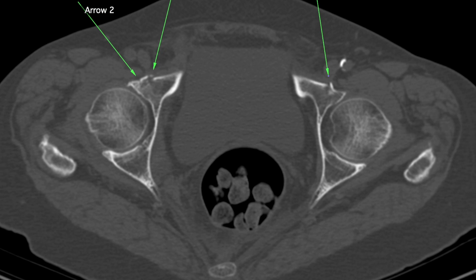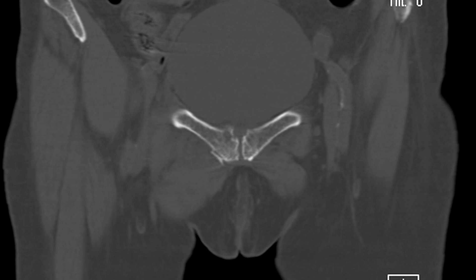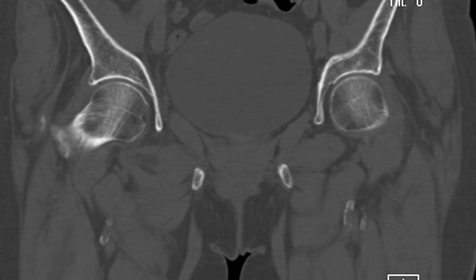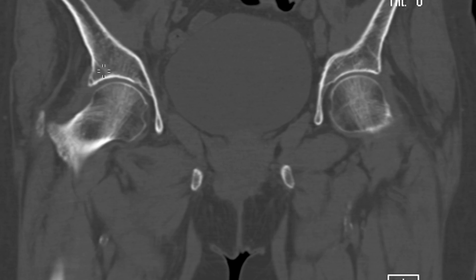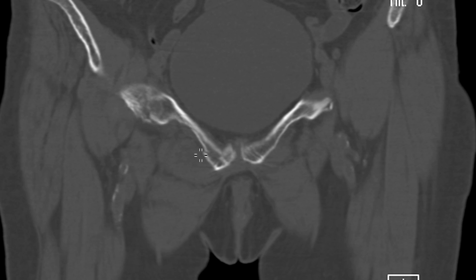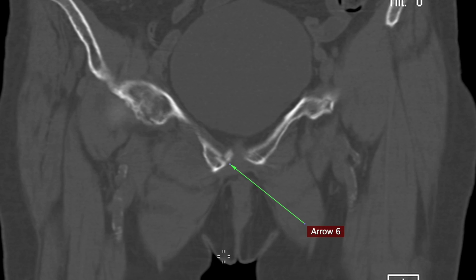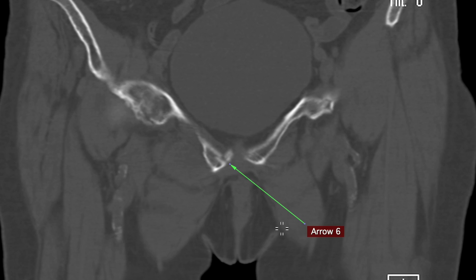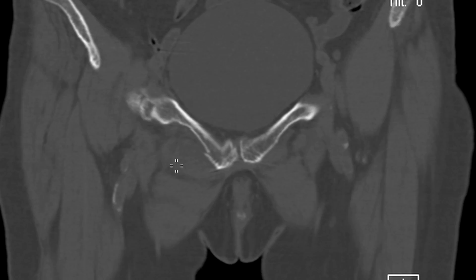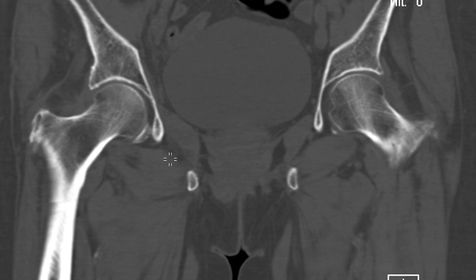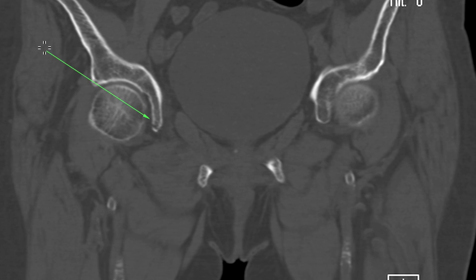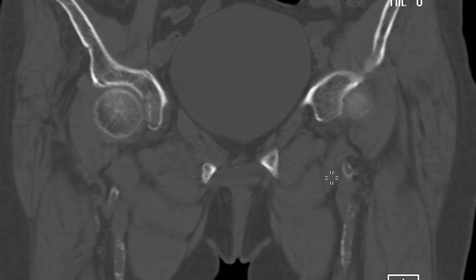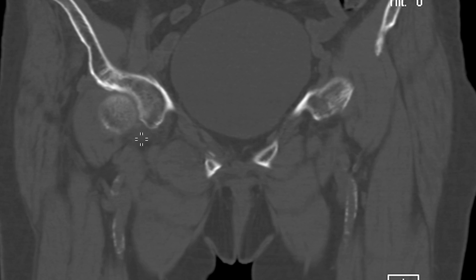Then looking at the other side, something catches our attention — we also have some cortical disruption there, so there's another fracture on that side. For those who are not radiologists, it might be hard to see on the axial projection, so the coronal projection is a lot easier for learning this type of imaging because it correlates with the radiograph. Going back to the radiograph view — we have that fracture there; it's not identical to what we saw on the radiograph, which is normal, since on CT we really only have one slice without the addition of overlapping structures.